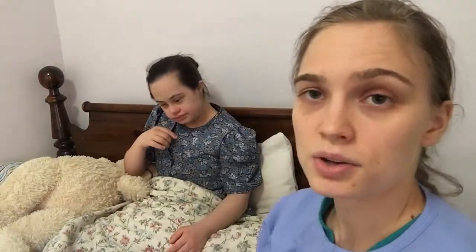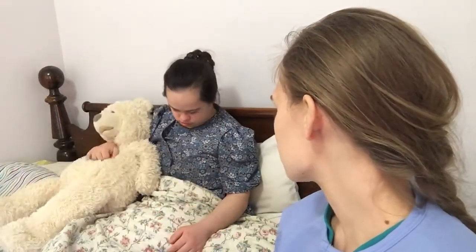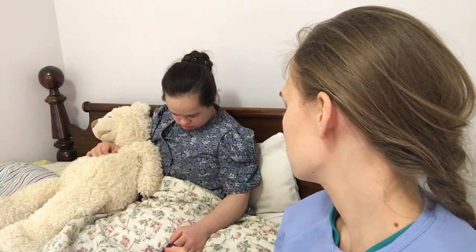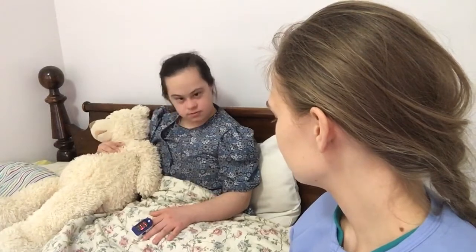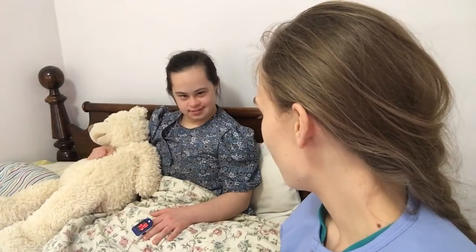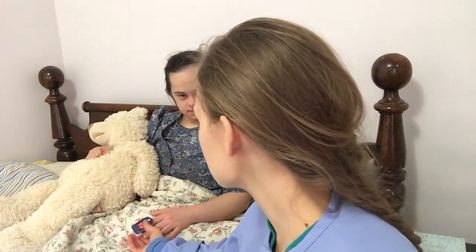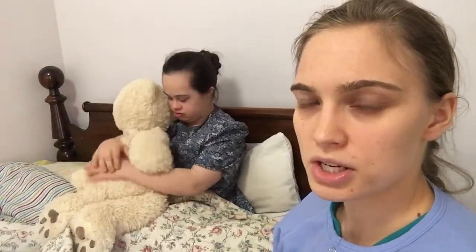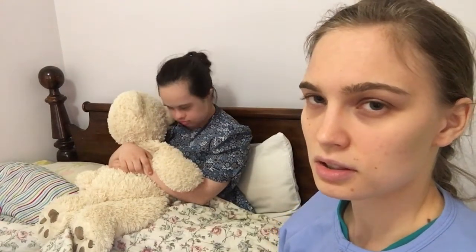I'm going to get a pulse ox. I have a little pulse oximeter right here. I would typically use it on the patient's finger. I'd wait to see what it says. It says her oxygen levels are 96 and her pulse is 67, and that's within the normal range. 95 to 100 is the normal range. Anything less than 95 indicates there is not a good level of oxygen perfusion in the body.